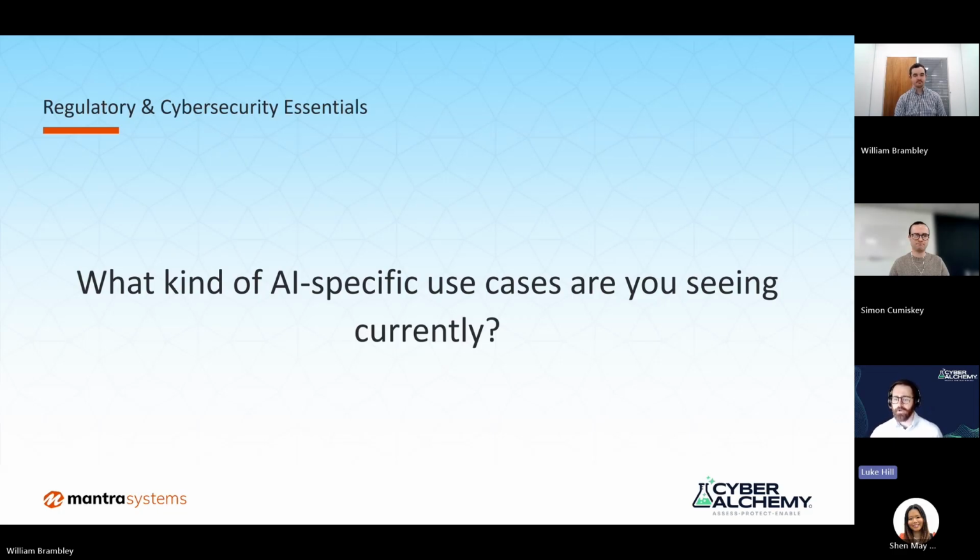But just on the cloud stuff, we frequently see issues where people just want to tap into a cloud provided model, which is super easy to integrate, and training an AI model is very, very expensive, and the hardware that you need to run it on can be quite expensive as well if you're going to be running something like an LLM. But then it can bring issues around data residency and training and ownership of that data as well. If any of the audience are thinking about tapping into those cloud models and bringing them into their systems from an AI perspective, and if you've not thought about it already, then please do consider that, because it's quite an important thing to get right. I think very important for sure.